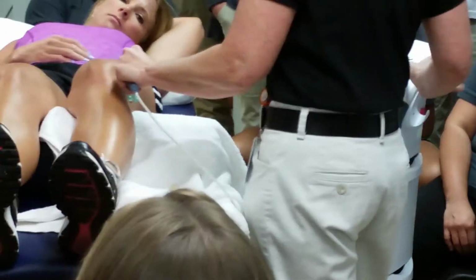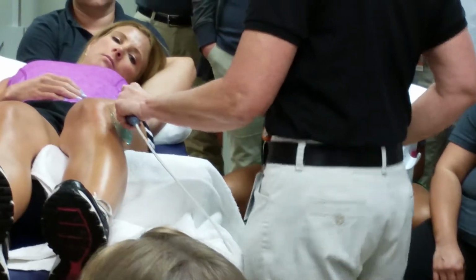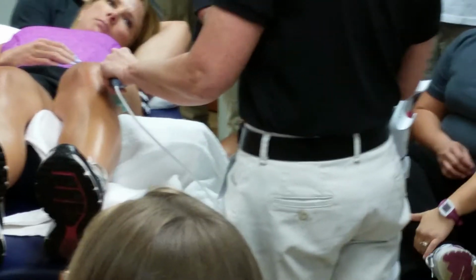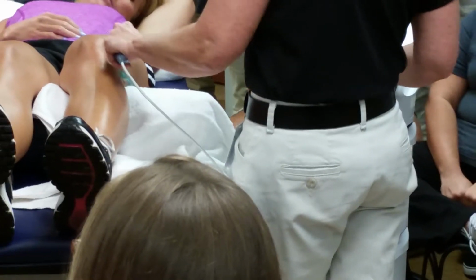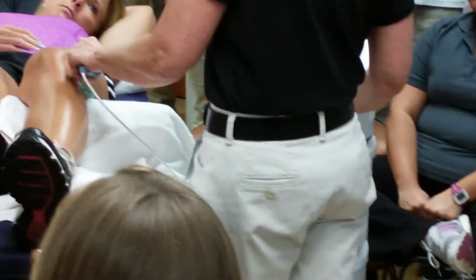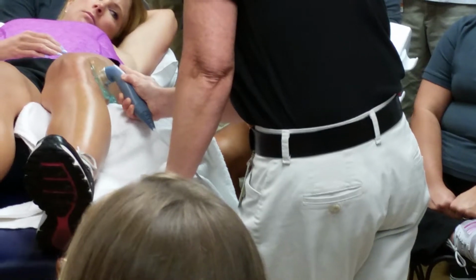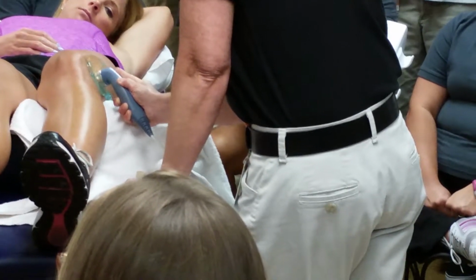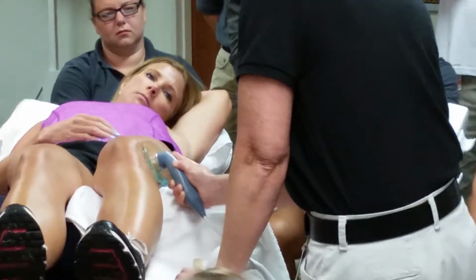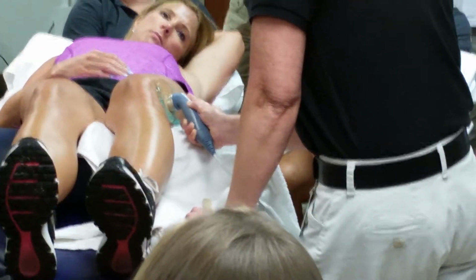All right. So I have it on 0, so I'm going to start. And what you have to learn how to do is be able to do 2 things at once. So that's why you kind of want this close in your line of view. And then I can turn this up. And then I have to wait a minute or so to see if she starts to feel the intensity. And if she doesn't, I can turn it up until we get to that.